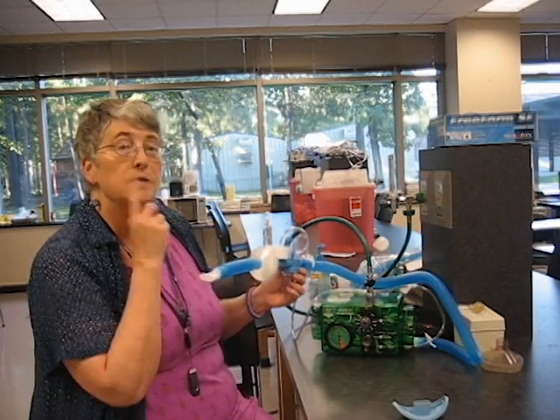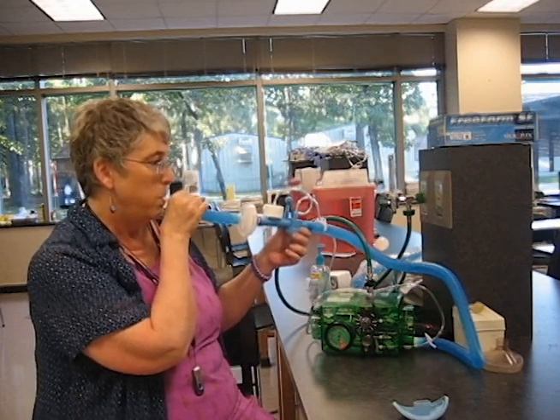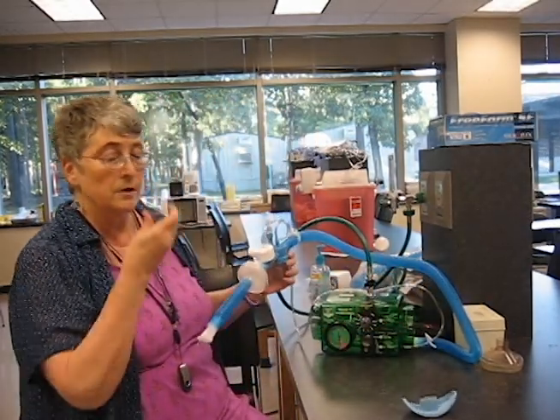Now the other thing a person can do is a patient can leak through their nose, so I'm going to show you what that looks like. Now, take care of that problem with putting nose clips on.